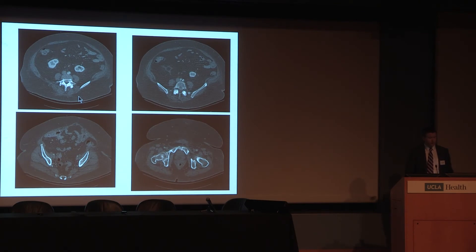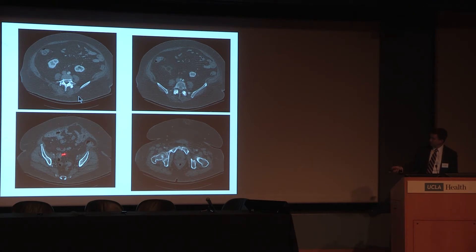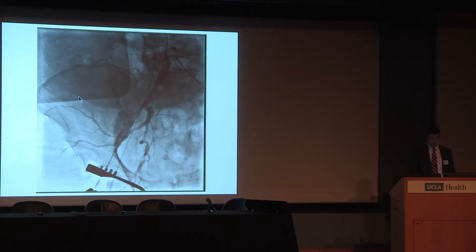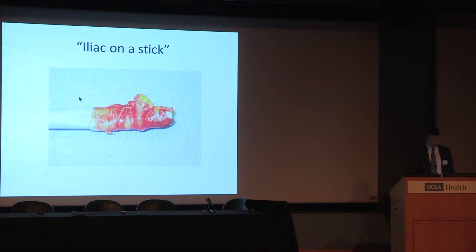This would be an example of a typical high-risk patient. You can see the amount of intra-abdominal and extra-abdominal fat. There's a very small aorta in this patient, very small iliac vessels coming off the bifurcation, and it's difficult to see the externals. Down at the femoral head by the groin, these are small common femorals. This is a high-risk patient — somebody to be careful with. What you don't want at the end of your procedure is a blush of contrast at the external and a bleeding emergency.